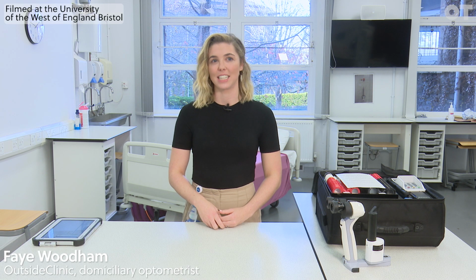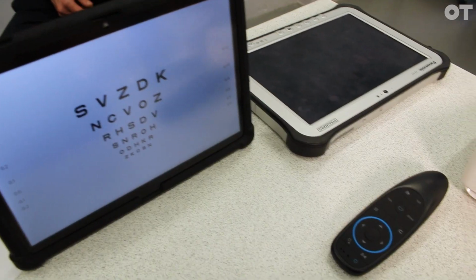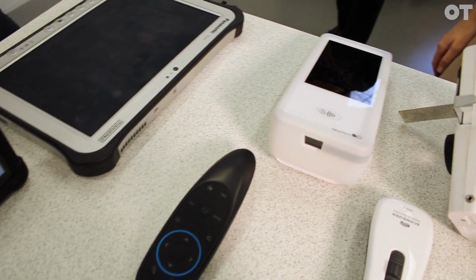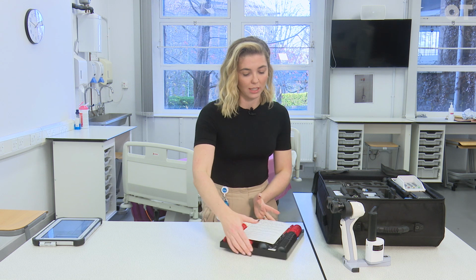My name's Faye, I'm a domiciliary optometrist and I work for the Outside Clinic. So I'm going to be going through some of the equipment that we use when we're testing in someone's home. It all has to be small enough that it can fit inside a bag so that we can take it into someone's home. Our trial sets are condensed because a full trial set is a little bit cumbersome.